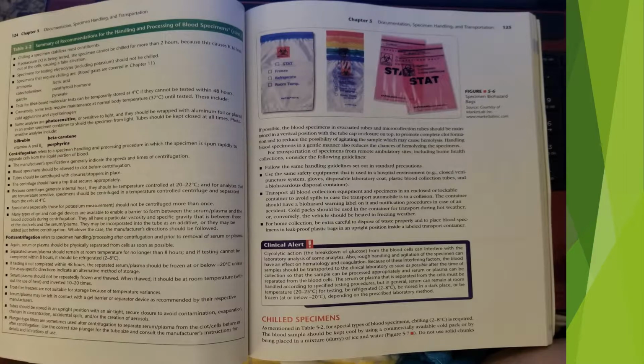The serum or plasma that is separated from the cells must be handled according to specified testing procedures, but in general, serum can remain at room temperature, 20 to 25 degrees Celsius for testing, be refrigerated 2 to 8 degrees Celsius, or be stored in a dark place, or be frozen at below negative 20 Celsius, depending on the prescribed laboratory method.